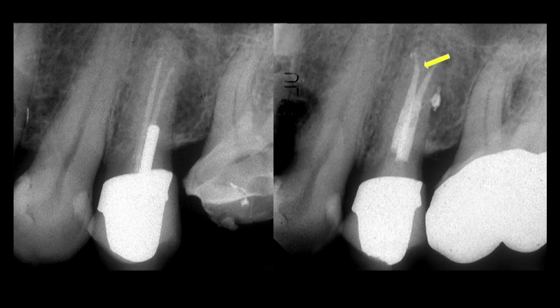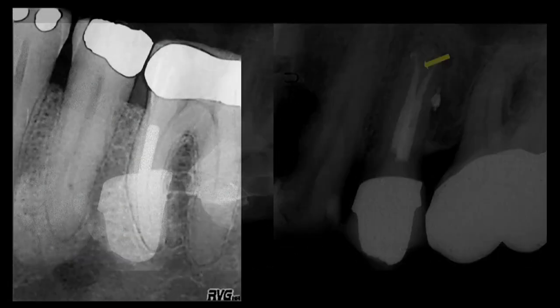But if you look where the arrow's pointing, instead of having a nice smooth contour, it has a little bit of a bump. Again, it may not be clinically significant, but we never know when results are going to be clinically significant in terms of the quality of the obturation.